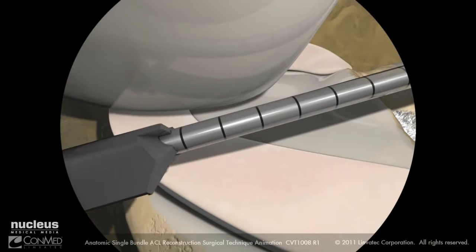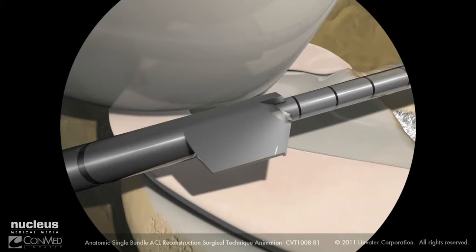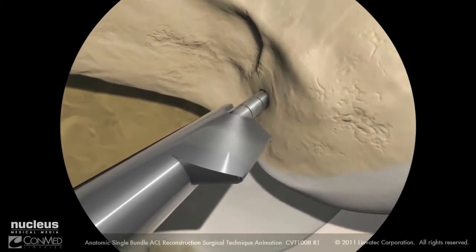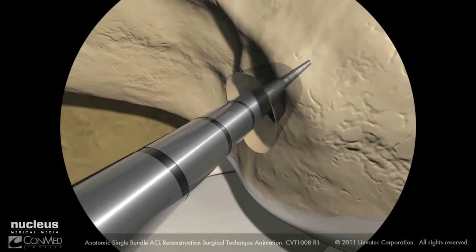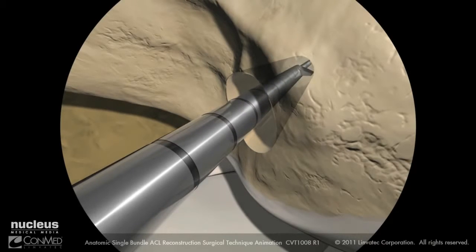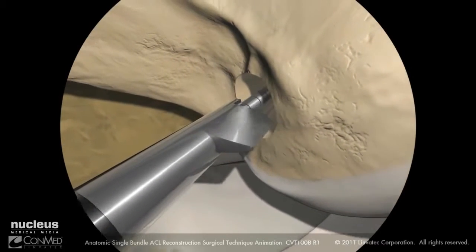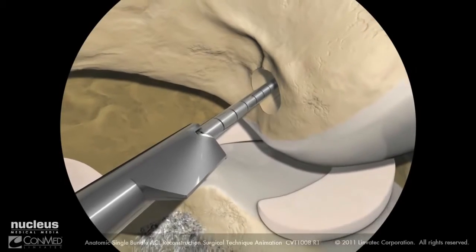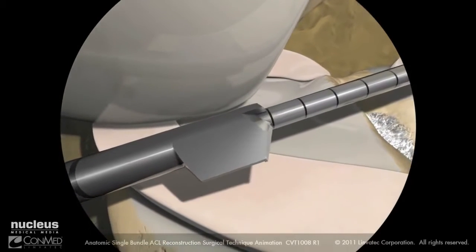Insert the mono-fluted sentinel drill bit over the guide pin through the accessory anteromedial portal with the cutting edge facing away from the femoral condyle, and advance the drill bit to the femoral ACL footprint. Using a piston-like back and forth motion, advance the sentinel drill bit to the desired depth cautiously to prevent blowout of the lateral femoral cortex. Pull the drill bit back slowly until the blade is visible in the joint space. Keeping the hand off the trigger, slide the sentinel drill bit past the medial femoral condyle and out of the portal, making sure to keep the blade oriented away from the condylar surface.